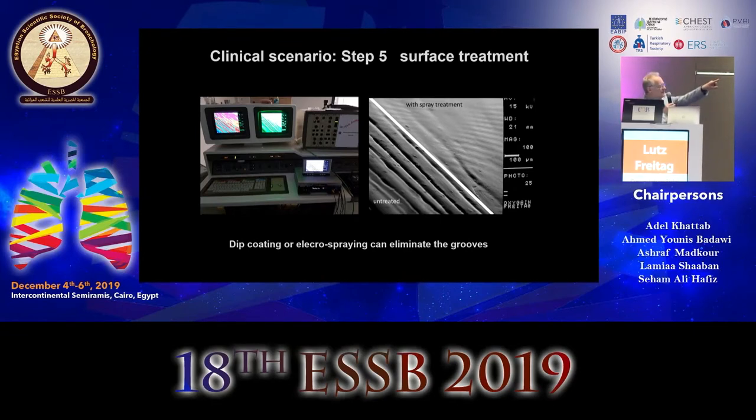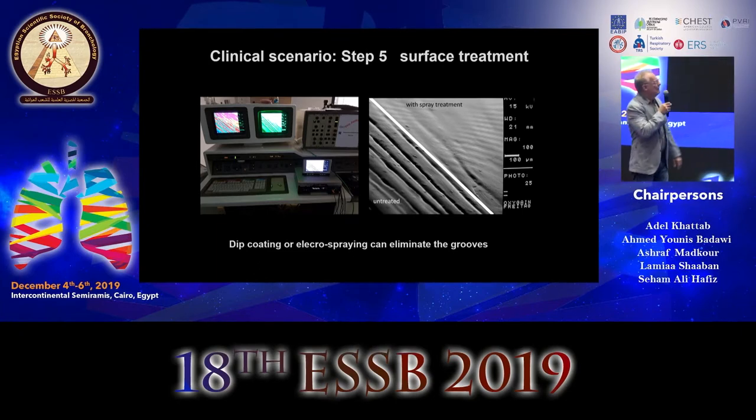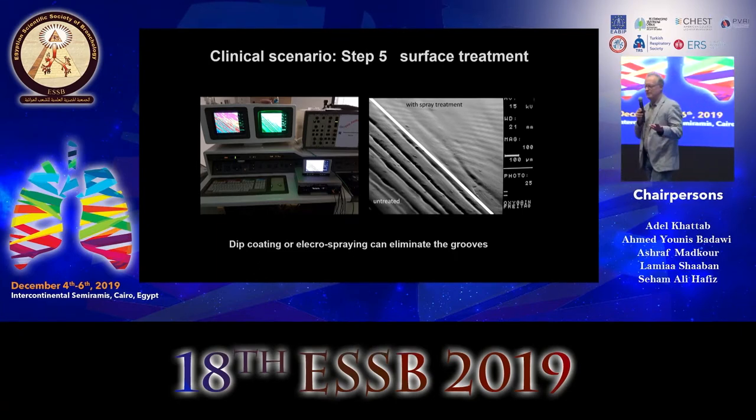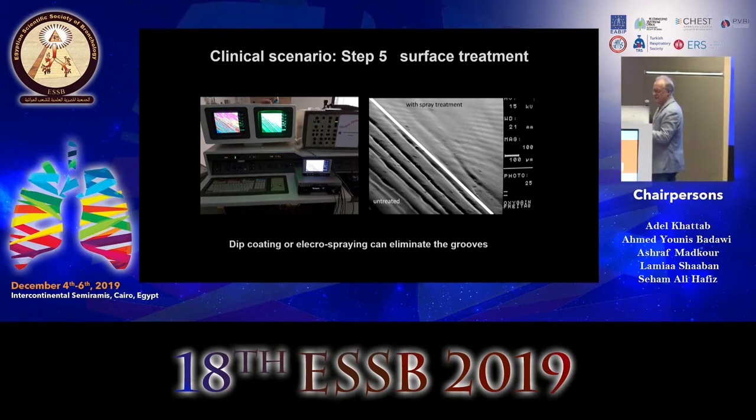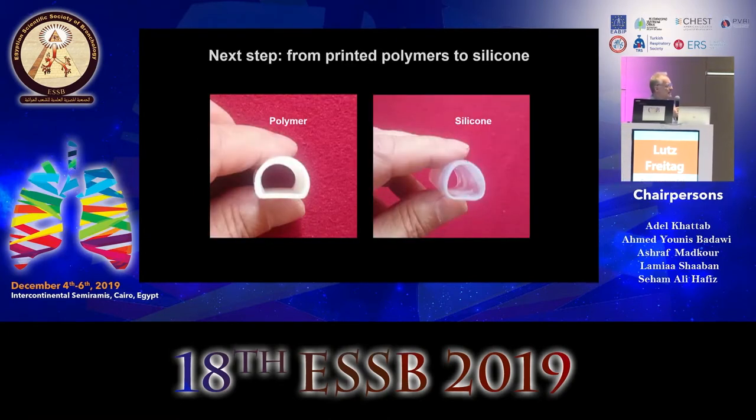You can even modify the surface. On the left side, you see in my electron microscope the untreated stent, and you can spray other polymers over it, and you have a very smooth surface. So, a fascinating technique.